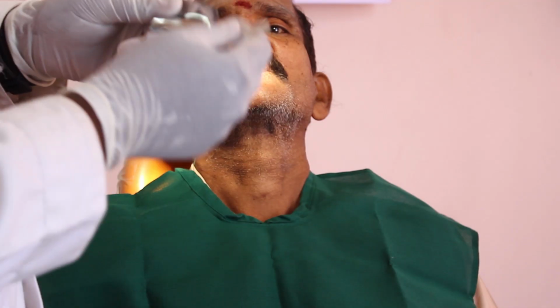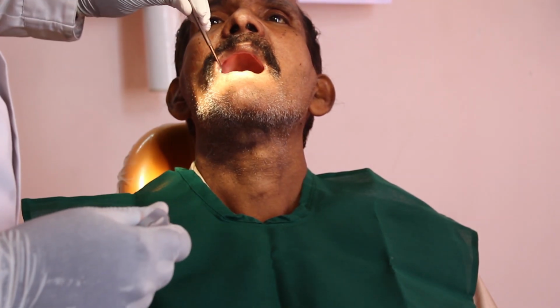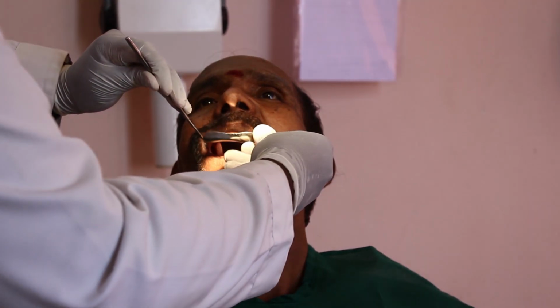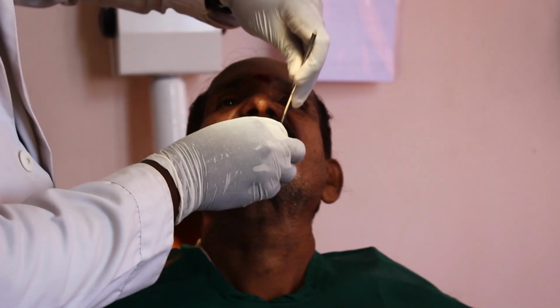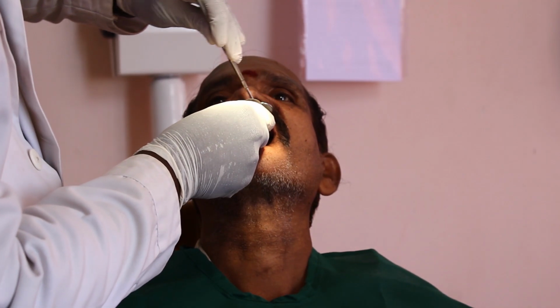While placing the tray, first you have to retract the patient's cheeks by using the mouth mirror. You have to place it on the patient's right side corner of the mouth, and you have to retract it. At the same time, you have to insert the tray by pushing the other side corner of the mouth, and you have to rotate it, and then seat it in the patient's mouth. After seating it, using the mouth mirror, you can reflect the cheek tissues and seat the tray.